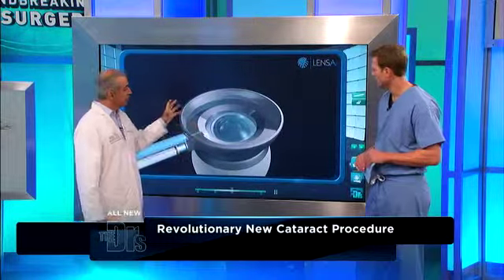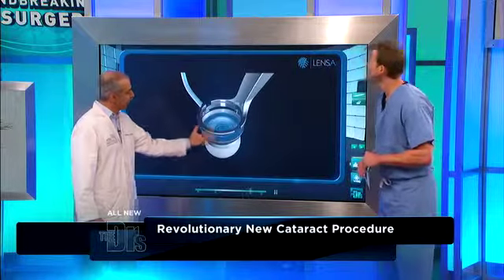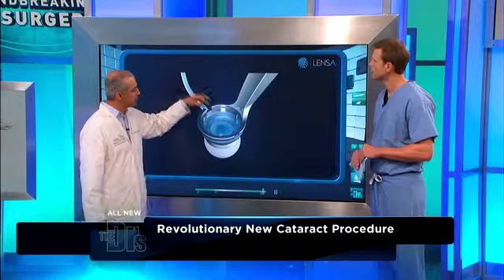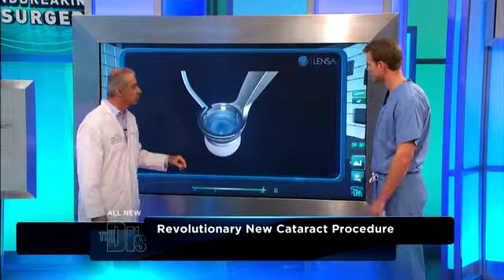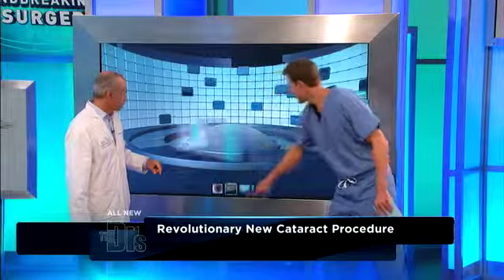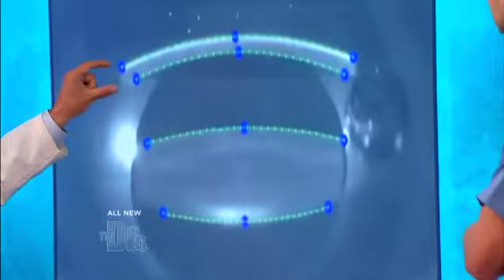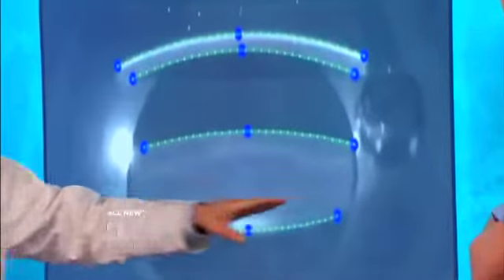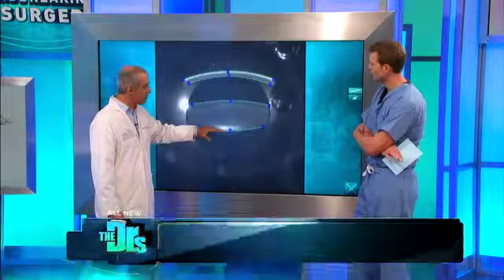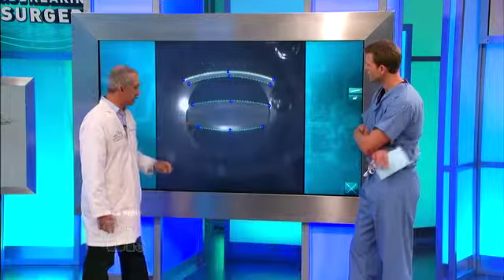The LenSx system couples itself to the eye. This is the laser cataract approach that's revolutionary. There's a water fill so that the laser can look into the eye and be able to treat everything and see everything without actually touching the eye itself. So you're going through water. We're going through water, and this is what the laser sees. It sees the cornea and outlines it for itself. This is what the laser's camera sees, and then it outlines the cataract itself so that it'll know the outer boundaries of the cataract, so that every single laser pulse will land exactly where it's intended to be.